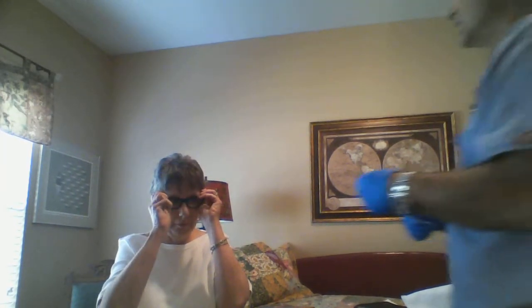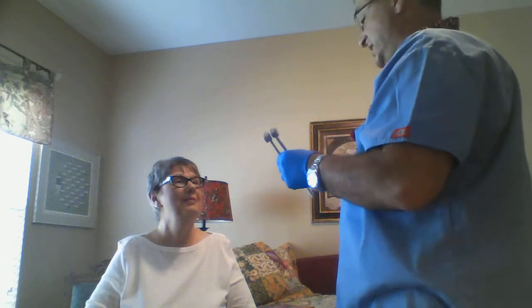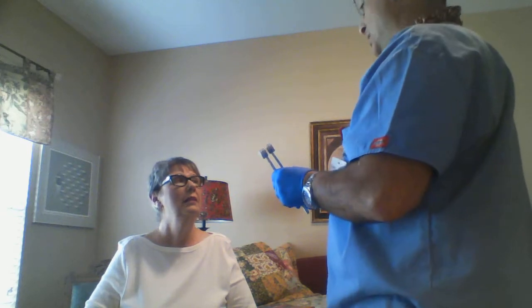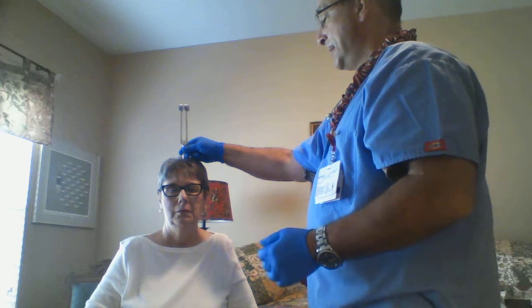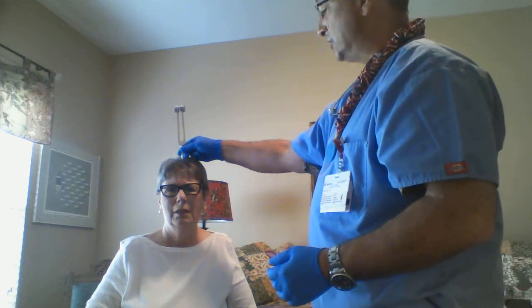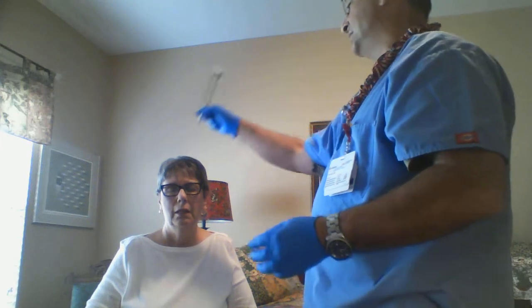All right. Now we're going to do a couple of hearing tests. And the first test we're going to do is called the Weber test. So I'm going to strike this and put it on the top of your head, and I want you to tell me if you hear it in one ear or the other ear or in both ears. I think that one. Do you hear it mostly in both ears though? Mostly in both ears. Okay, good. That's what we want.